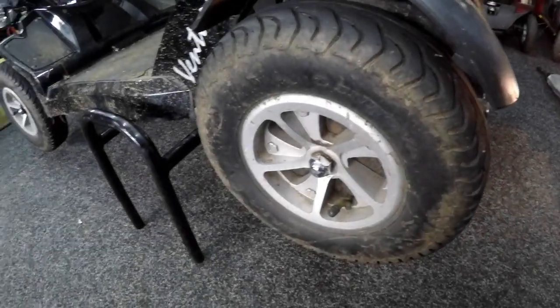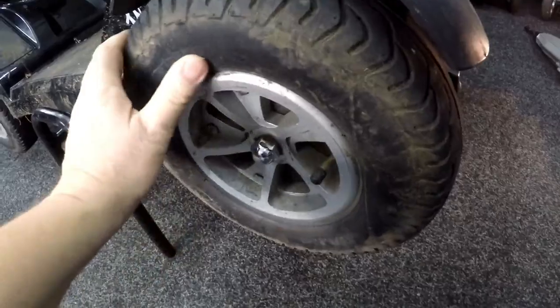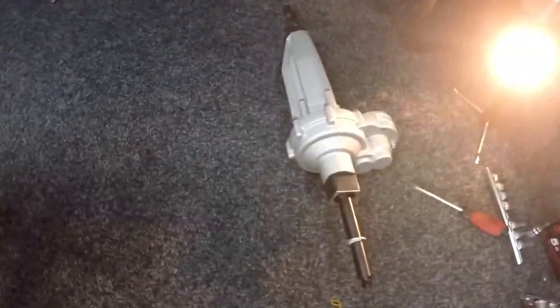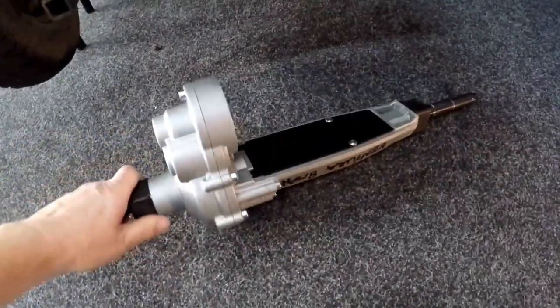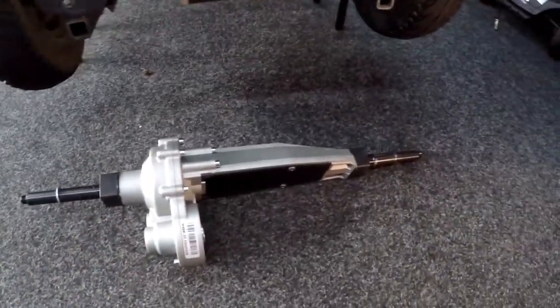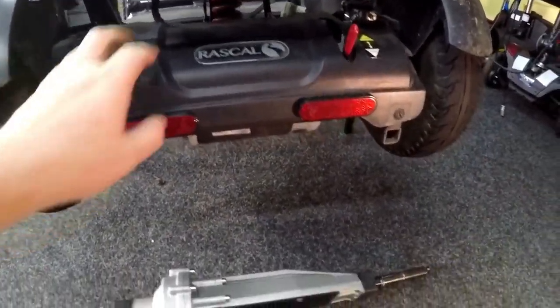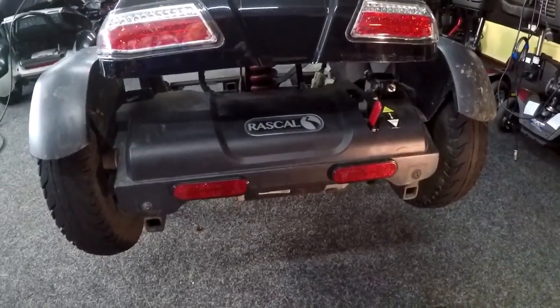So now we know that the bearings are gone in the transaxle. If we replace the transaxle, it'll not run like that. So we've ordered in a new transaxle. That'll go on like that, like so, onto the wee Rascal here. So we need to remove the body panel and the transaxle. So that's what we're going to be in the process of doing now.